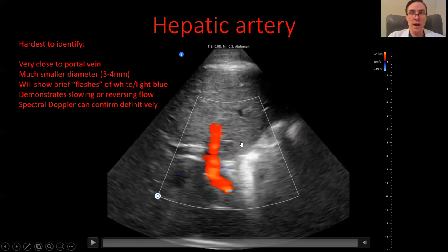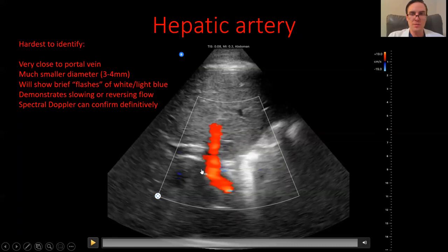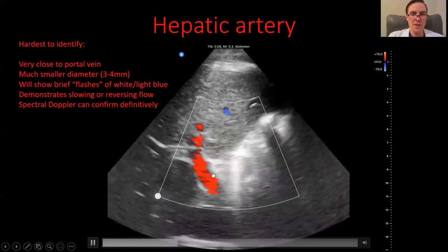Unfortunately, the Butterfly IQ does not have spectral Doppler functionality at the moment — they're currently developing it, which is something to be excited about in the future. If you really need a spectral Doppler measurement, you'll have to use a more traditional ultrasound. But I'll show you how to identify the hepatic artery with the Butterfly IQ here.